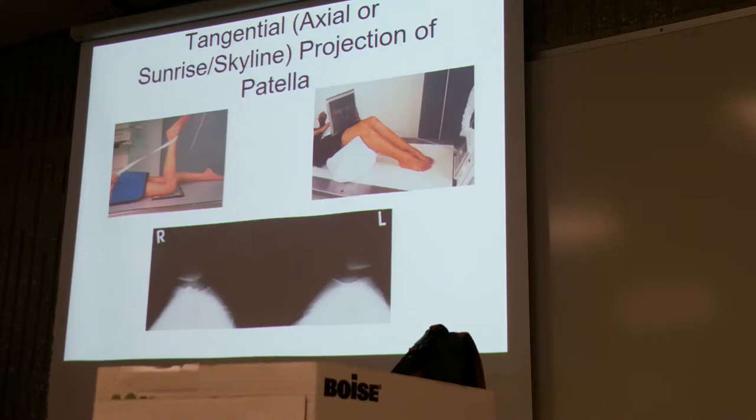We try to find out what it is that they can and cannot do and not force them into doing something they can't do. Because now you can exacerbate the condition and make it worse. I've had people who have forced a particular position on their patient and actually caused more trauma or additional fractures.